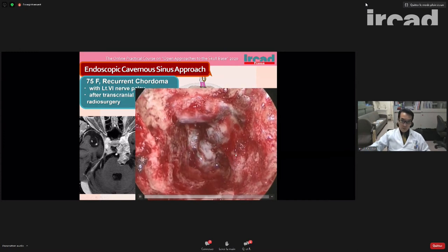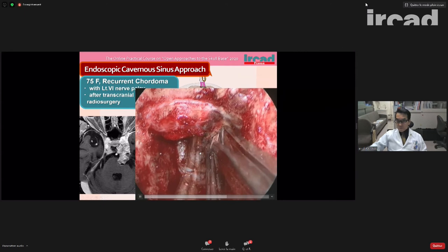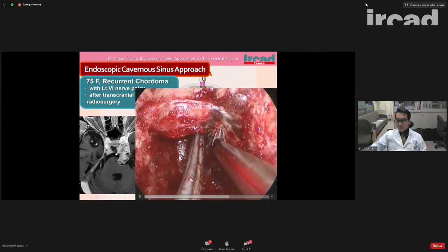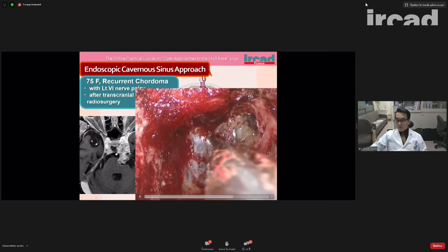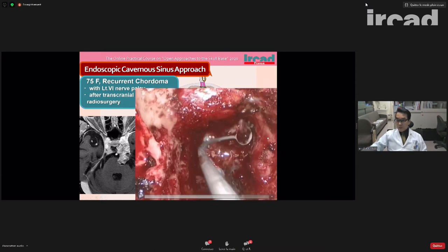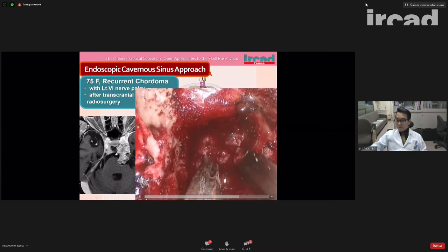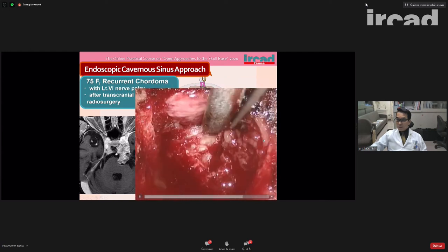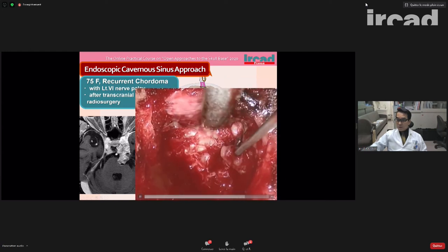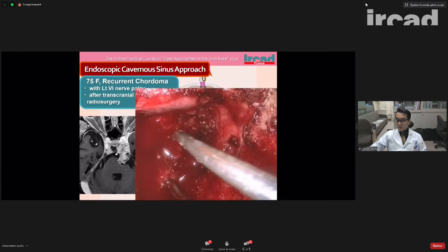You can clearly see the internal carotid artery here. So there is a tumor around here. So we start the dural incision, and you can find the tumor here. And usually the skull-base chordoma is easily dissected from the internal carotid artery. Then we gradually proceed with the tumor resection here.